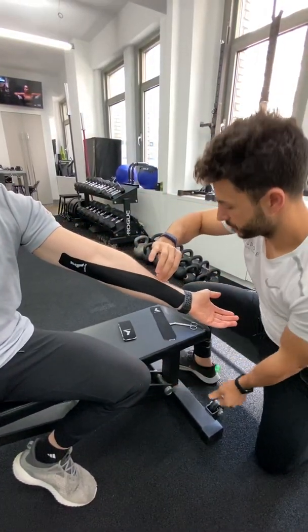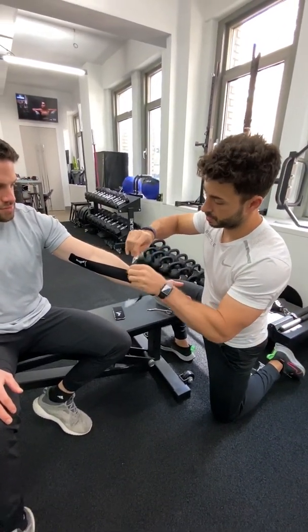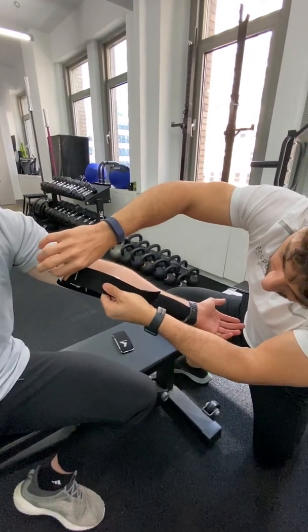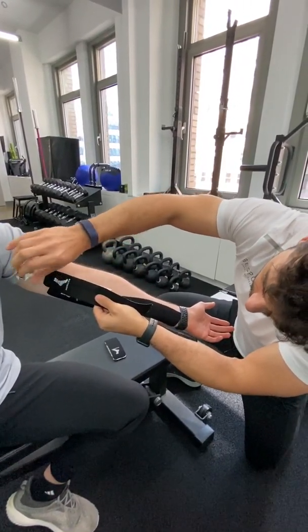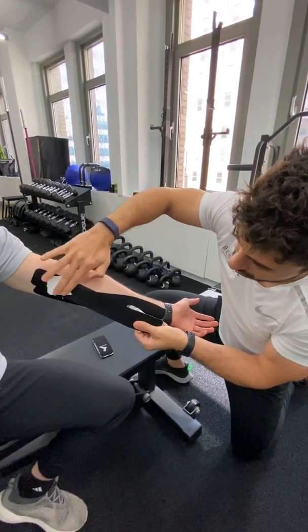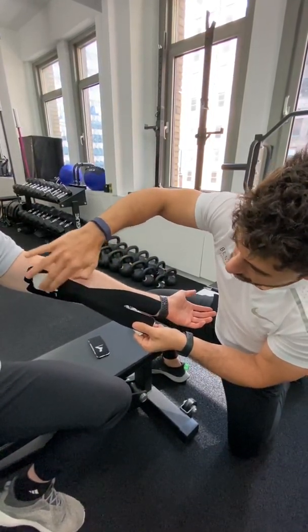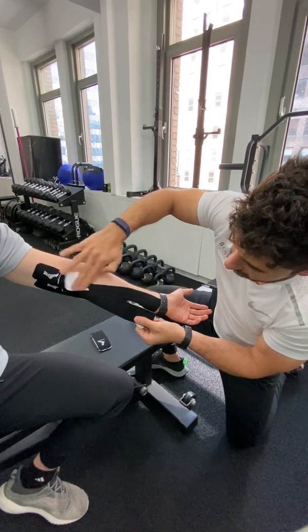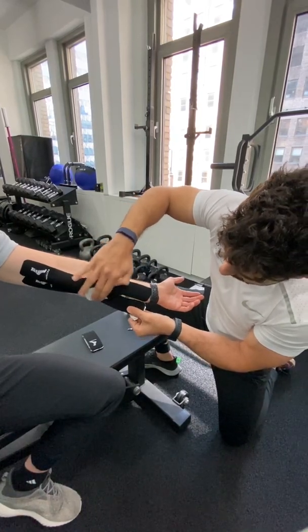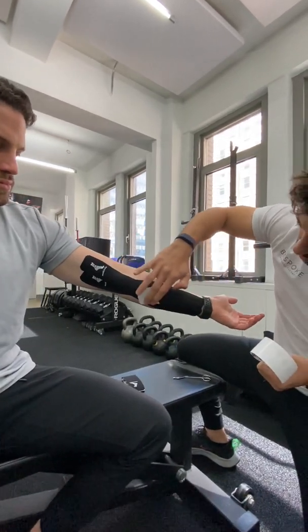What we're going to do with the next strip is we're going to go across the area, across where it feels the pain. Same thing — break it, 0% stretch, anchor it down just right above. Heat activate, 50 to 75% stretch. And what I'm going to do is just cross that area to get a little more lift in the skin and get a little more blood flow back to this area. Feel the stretch, and then 0% stretch at the end to anchor so that it stays anchored without coming up.